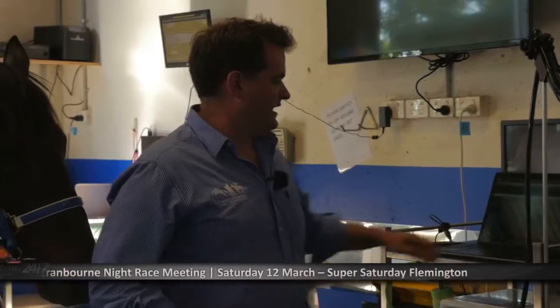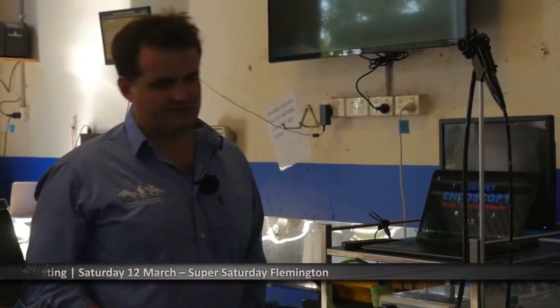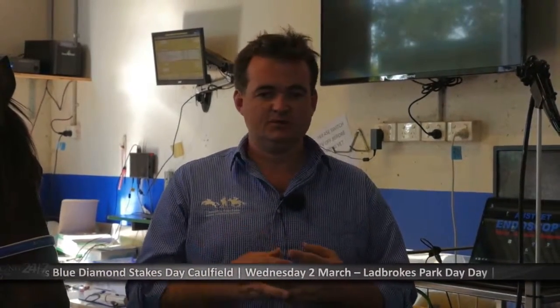Now, what do you do with all of the recordings once this is all finished? With the recordings, they're all stored in a file for each horse. So each horse has its own digital file, so that if we notice something, if the trainers or the track work riders report the horse is making an abnormal noise at exercise or poor recovery, we'll go back and look through the history. Every time we do a scope, we grade the function of the larynx. So it's graded on a 1 to 4 scale, 1 being completely normal, 2 being slightly asymmetrical but full abduction.